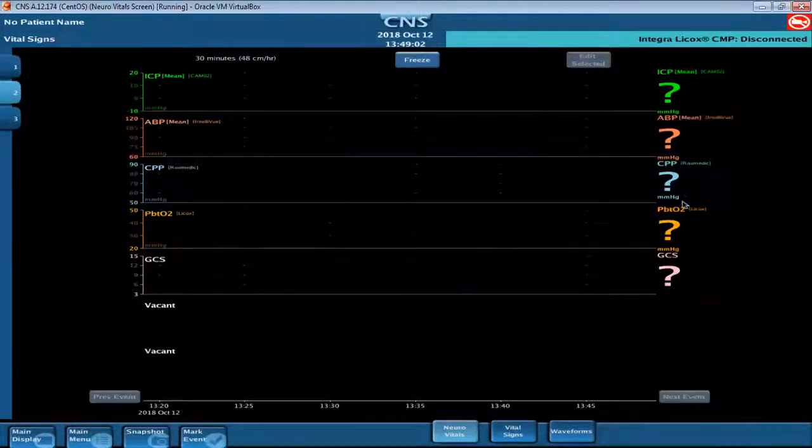And are there other parameters that you find really useful to modify that label? Actually not. It's really just blood pressure. The blood pressure is the most. Yeah. Okay, I'm going to start implementing that on my protocols. And once you do it as part of the protocol, it will actually hold that. But that would be a change that you would then need to save as part of the protocol. Right. No, I like that though.